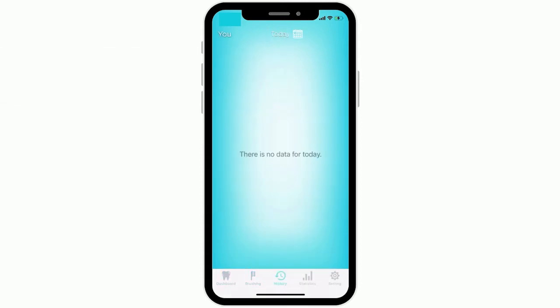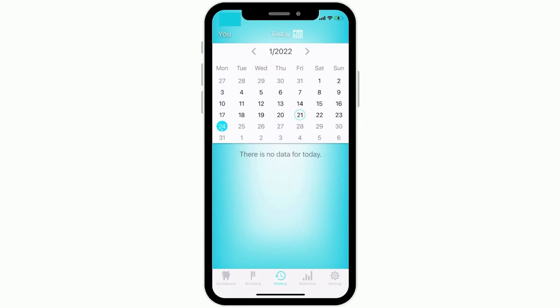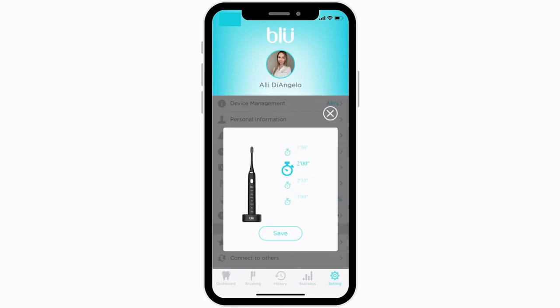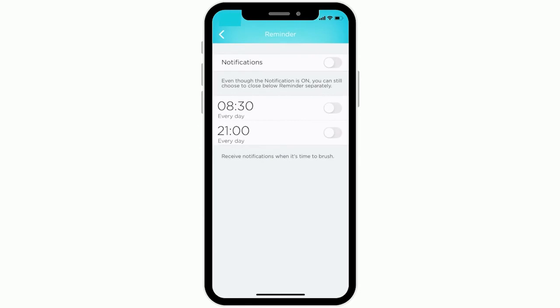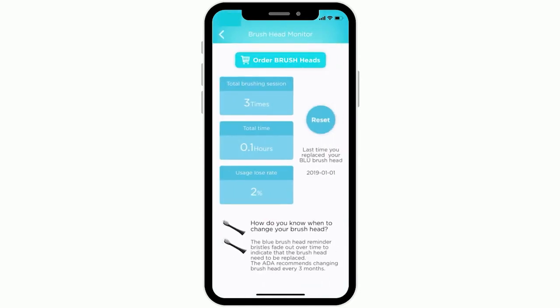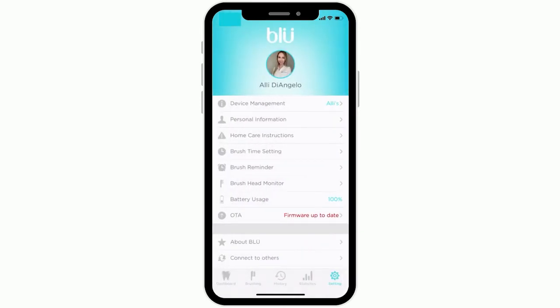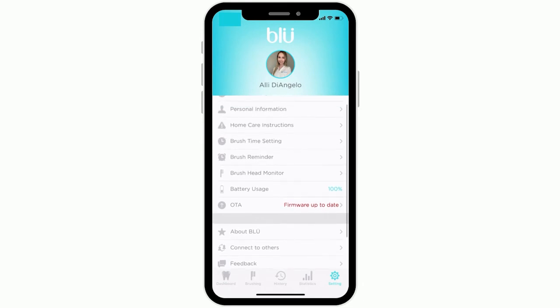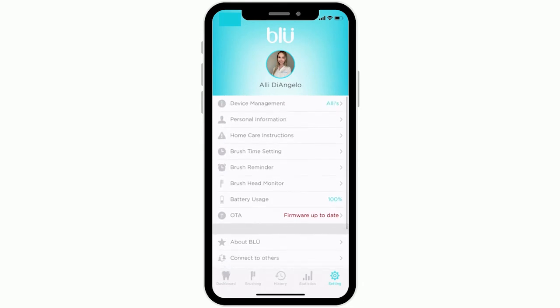You then can check over your data, and it will show you in your calendar the days you brush with a blue circle, as you can see here, on the days you've brushed to keep track of when you're brushing. Now you guys can go ahead into your settings and hit your brush reminders, and you can set a reminder for yourself. And when you go back to your settings, you can also hit your brush head monitor. And this will give you a section of when to start ordering your brush heads and going to your online shop.